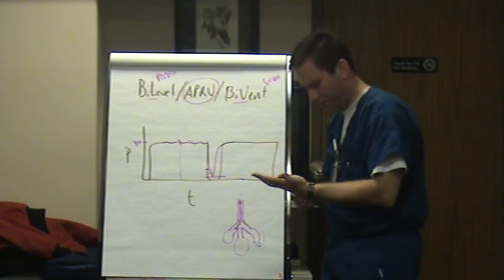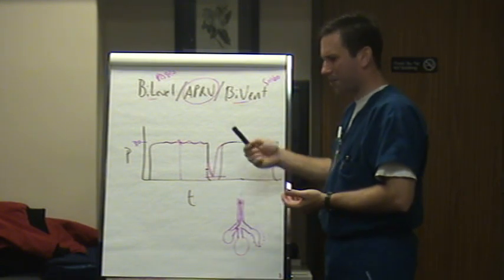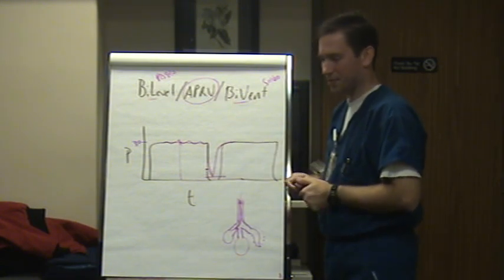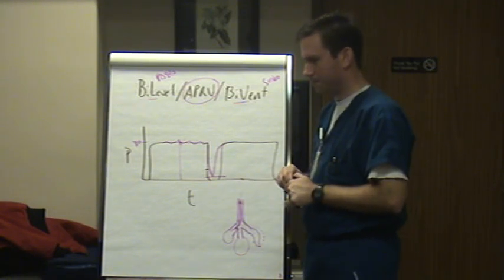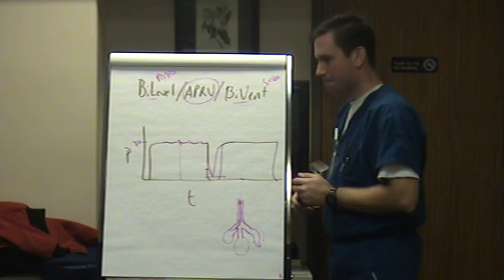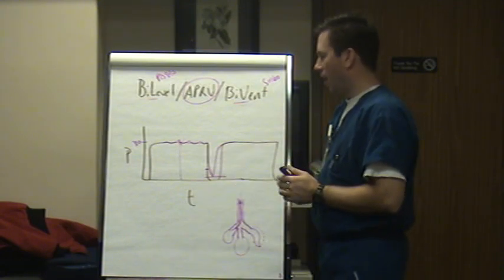Because I mean, we have PRVC, we got SIMV, we got volume support, we got pressure support. Why would I go to this when I have all those other choices? What does this allow your patient to do? It allows the patient to breathe on their own. It's comfortable. Okay. Control their CO2. Good. The patient can breathe on their own.